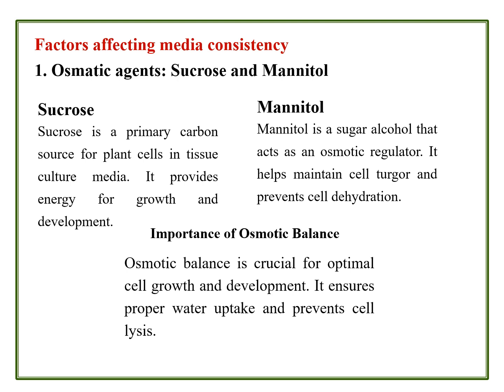Let us see what is the importance of osmotic balance. Osmotic balance is crucial for optimal cell growth and development. It ensures proper water uptake and prevents cell lysis. So that is the reason why sucrose as a carbon source, and sometimes mannitol, are frequently incorporated into the plant tissue culture medium preparation.